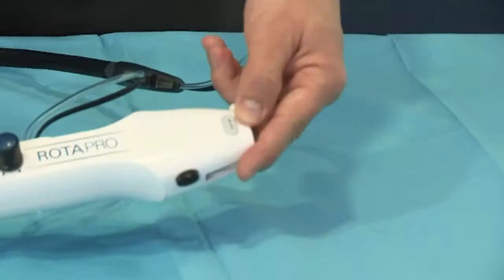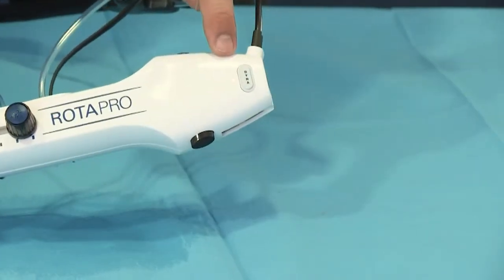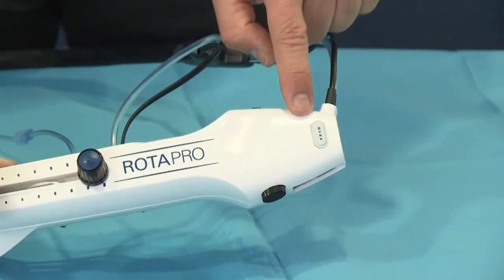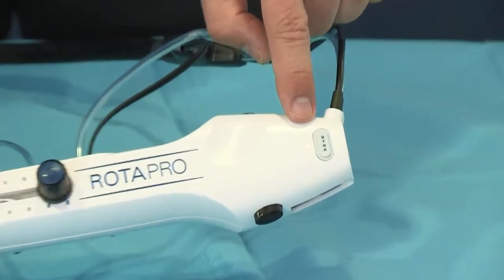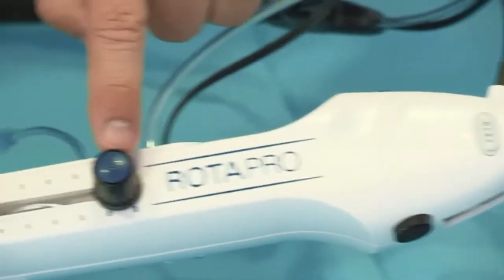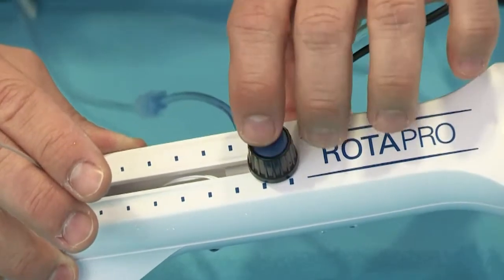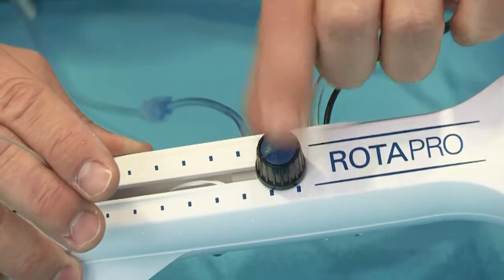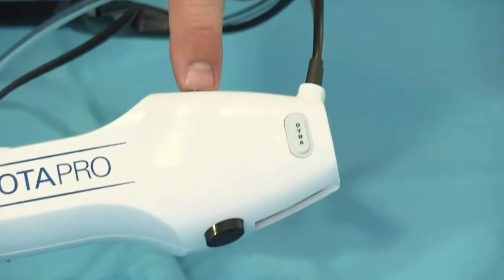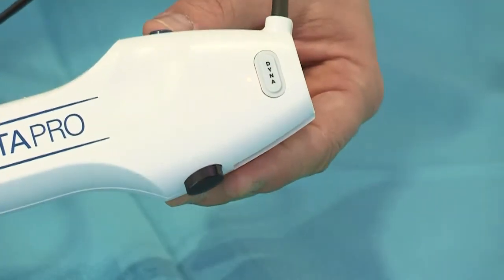How do we do that? Very simply by pushing on this knob here. You will see that there is a small light that goes on, informing that we are not anymore in rotablator mode, but we are in Dynaglide mode. Remember what I said before, that to activate the Dynaglide mode, we don't push on this button. If we do that, nothing happens. You see? It's just a safety measure to avoid mistakes. The only way to activate the Dynaglide mode, the motion in Dynaglide mode, is to push on this button here.